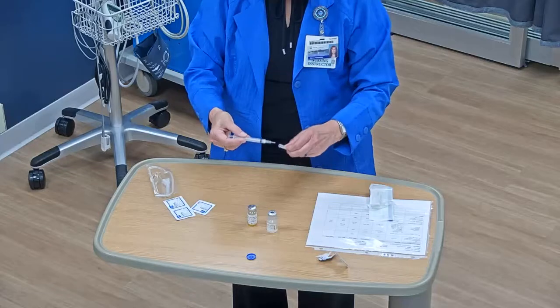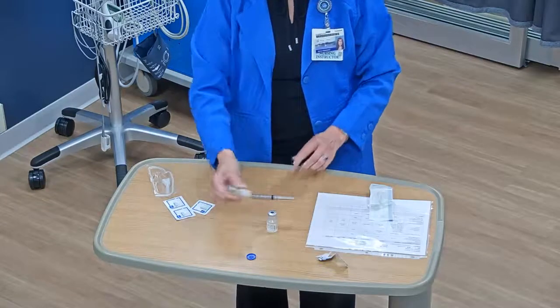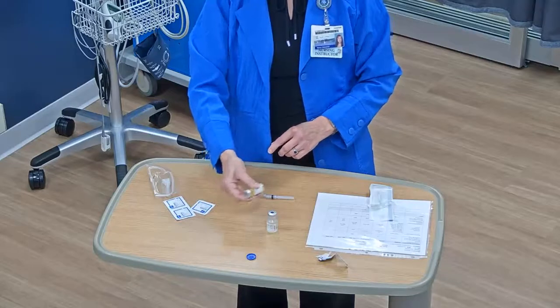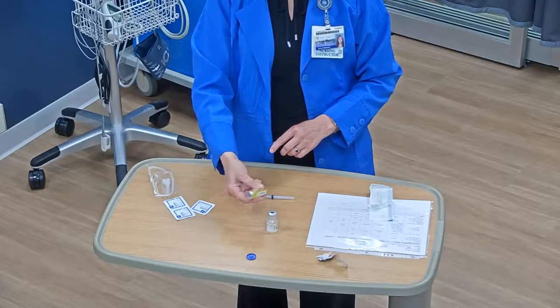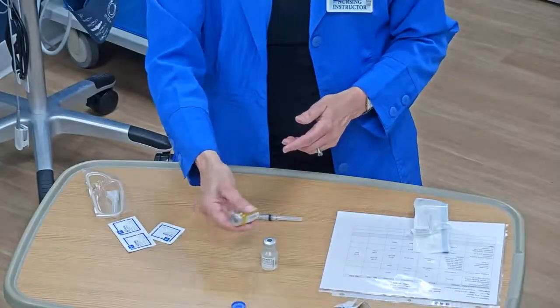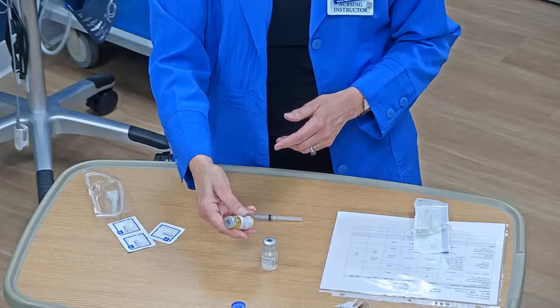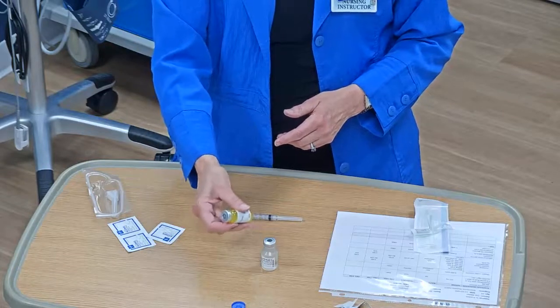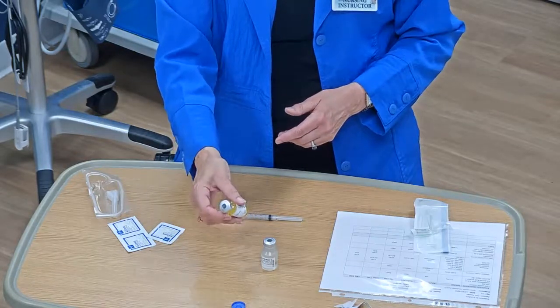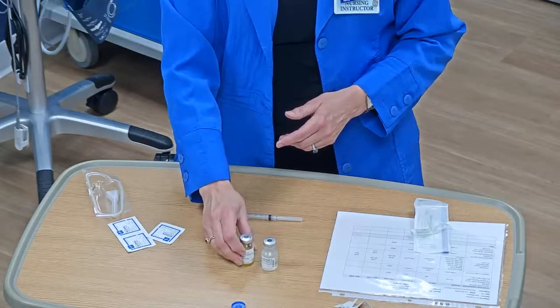Take the syringe out, give it a cap, and now you have to shake this. In your textbook it always says don't shake — just agitate it — but this will never mix up if you don't shake it. It's an antibiotic; you have to shake it. Once it's all dissolved, look and make sure you don't see any particles in there, then set it on the table.